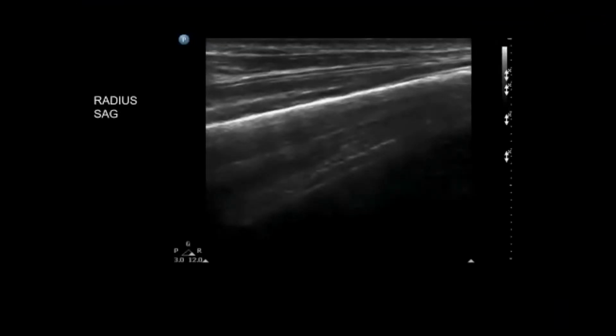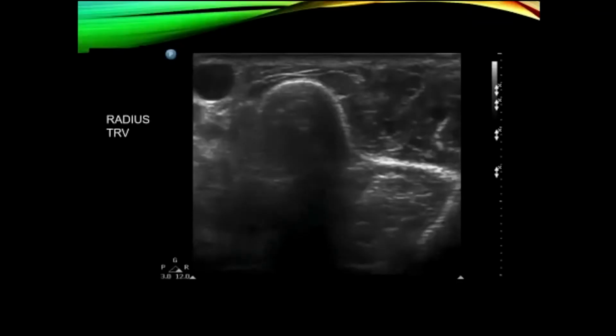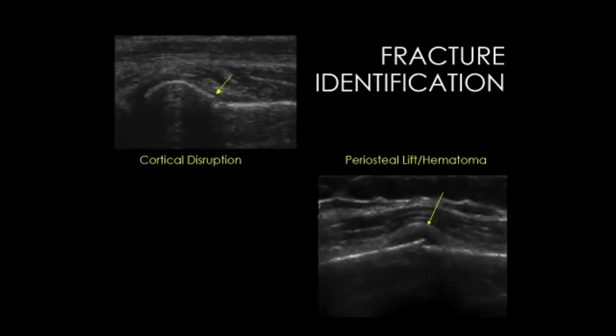So back to our scanning of extremities. So again, we have our normal bone. And then some of the things that you'll see with a fracture is a cortical disruption, so a break in the cortex. And sometimes there is actually a periosteal lift or a hematoma. I've seen this cited as a reliable indicator of a fracture, but I have not always seen it when I've scanned. So sometimes it's just the cortical disruption, and sometimes you'll get the periosteal lift. And my supposition, without any hardcore evidence, is that the hematoma is probably more likely if you have slight or greater displacement of the fractures than if it's just a hairline fracture and you just have a minor cortical disruption.